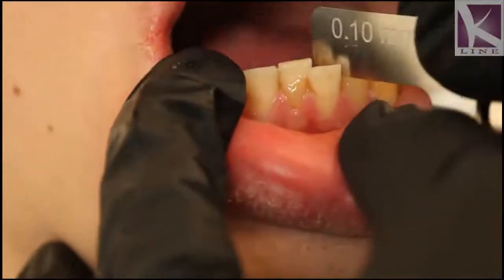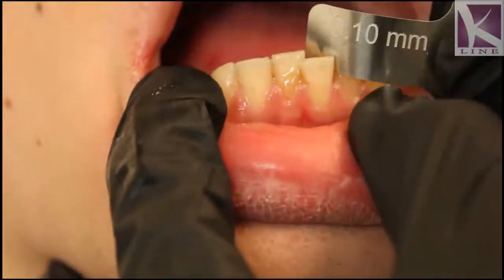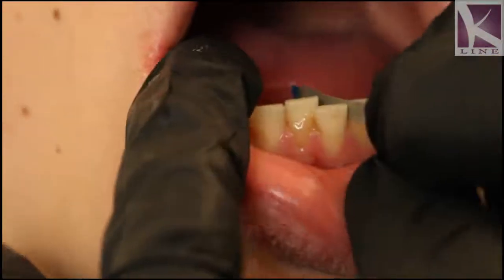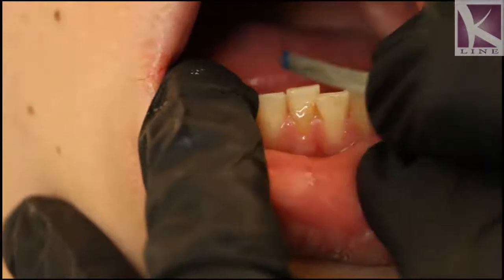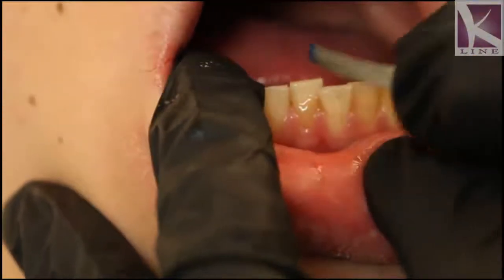Now I start to measure using my gauge. I still didn't even here reach the 0.1 mm, so I'm going to have to do more IPR. As you can see I'm just removing only from one side — this is a single-sided IPR strip.